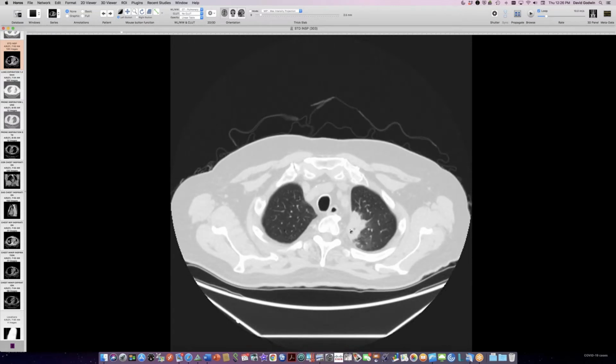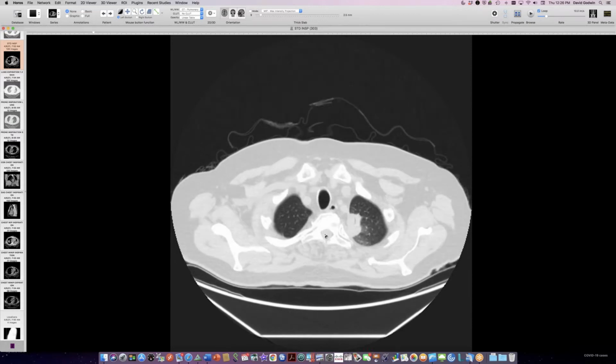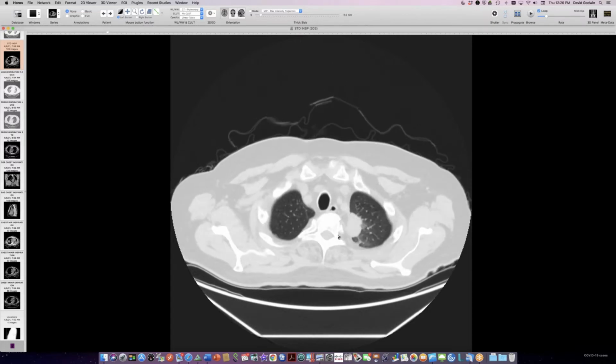So I haven't seen very much nocardia in the solid organ transplant population recently, but 15 years ago we did a study, and nocardia was a very common cause of nodules in people who'd had kidney, heart, liver, and lung transplants. So in solid organ transplants, nocardia is definitely on the list. Here's a case of nocardia. It's got a little air bronchogram in it. That's supposed to make you think about lymphoma, so that would keep the PTLD consideration live. I was very confident that I was making the correct diagnosis among these candidates. The aspergillus versus nocardia versus cryptococcus versus PTLD.